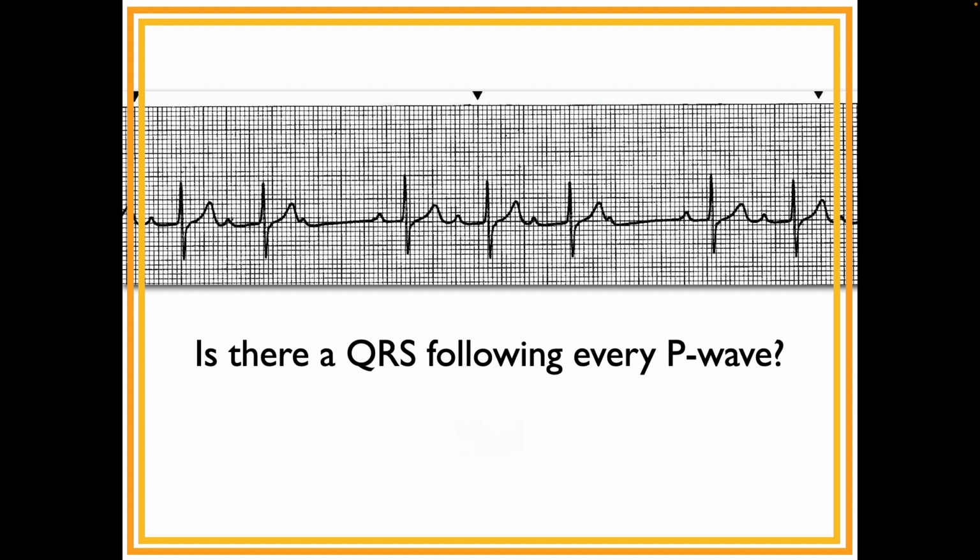Okay. And then, Natalie, what do you think here? So where are the P waves that don't have the QRS following? That lack a QRS, if you will. Yeah, I know, it's hard when you're just starting off. Yeah, Grace, go for it. I'll get you back for next week. You have one right here. Good. And then also one right here.